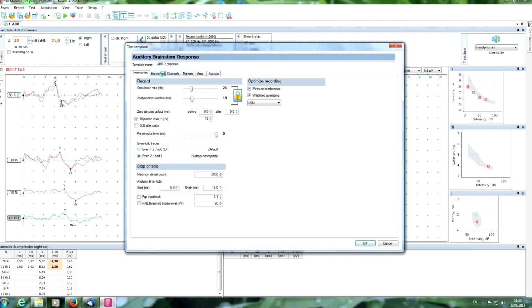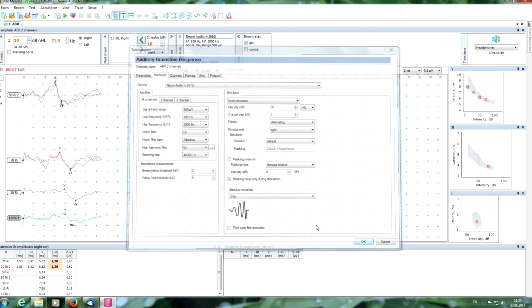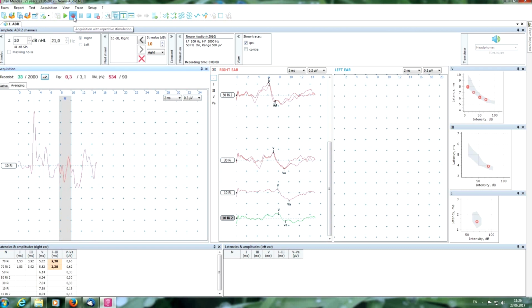Also, at near threshold intensity, you can perform the test using another type of stimuli, for example, chirp stimuli. It allows more simultaneous reaction of auditory receptors and allows us to get a larger amplitude wave. Okay, and start stimulation with chirp stimuli. As you can see here, the 5 wave starts to organize. Its amplitude is enough.